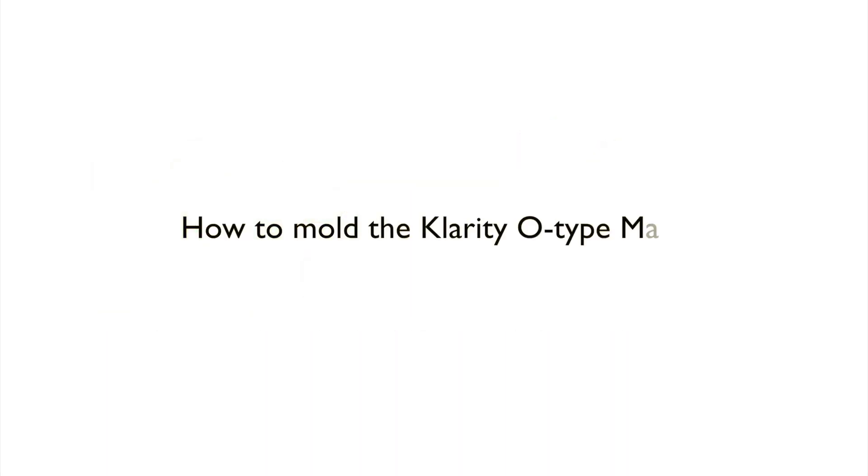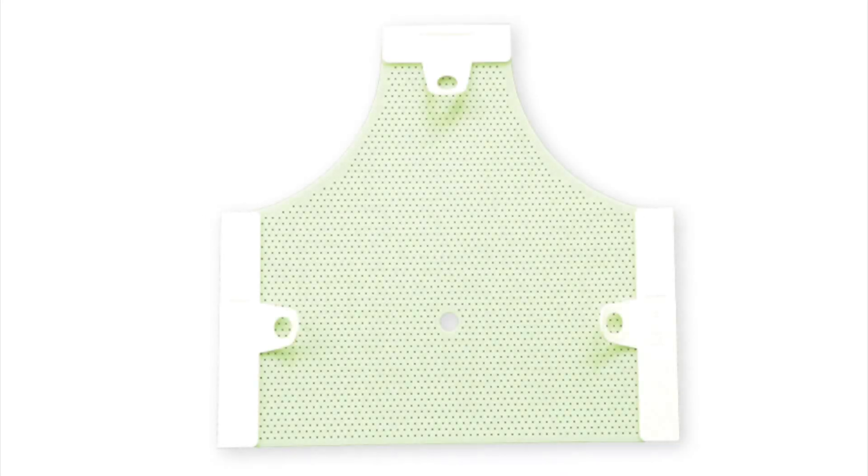This tutorial video will cover how to mold the Klarity O-type mask in our Klarity oven. Our green thermoplastic provides for a smoother molding process when forming the mask.